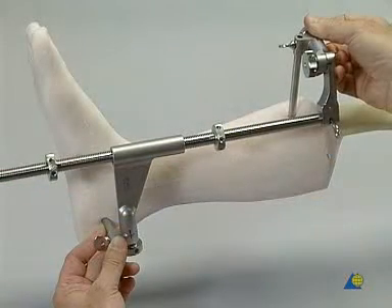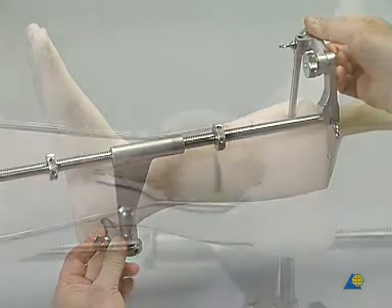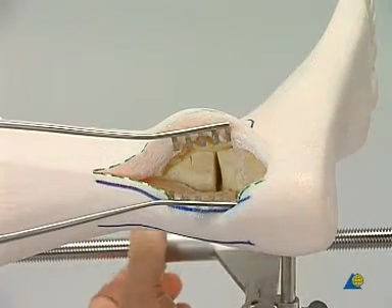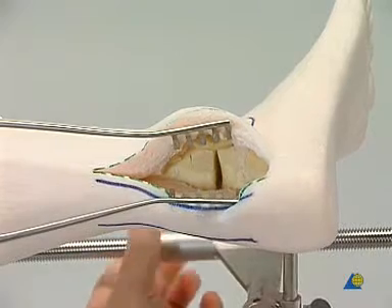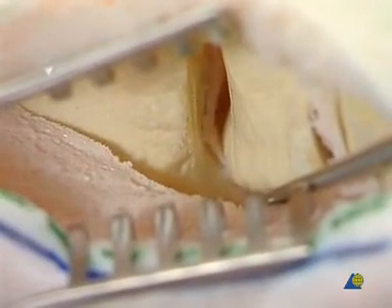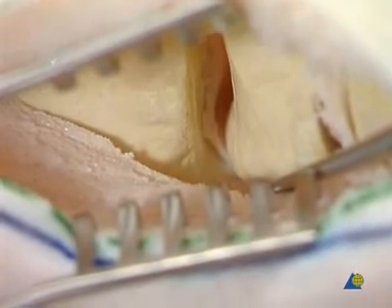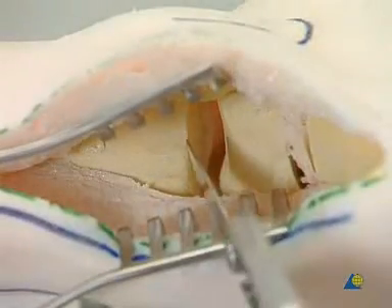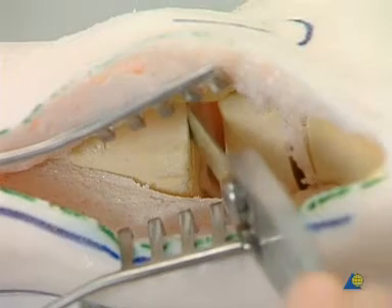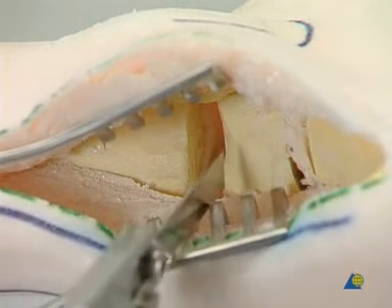The femoral distractor is placed between the tibia and the calcaneus on the medial aspect of the limb. The ankle joint is distracted. By progressive distraction, the whole joint is visualized. All remaining articular surfaces, subchondral bone, and other bone structures are removed to correct the alignment.